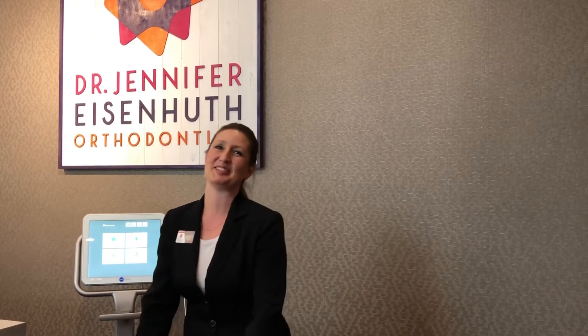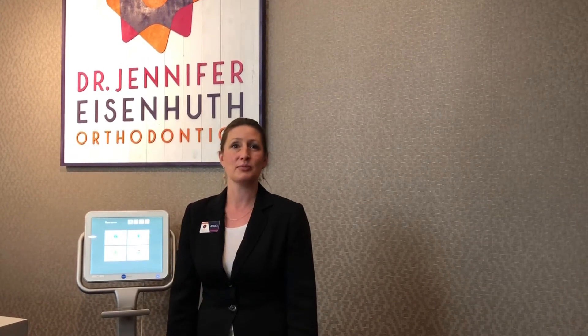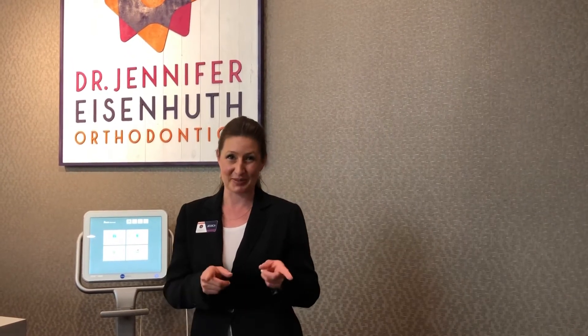I'm Jessica and today I'll be teaching you about using remote monitoring and your scan box. Remote monitoring works with your dental monitoring app and will prompt you each week to take a scan. Each scan will inform Dr. Jennifer of things like tooth positioning, broken brackets, broken wires, oral hygiene, and most importantly your treatment progression.